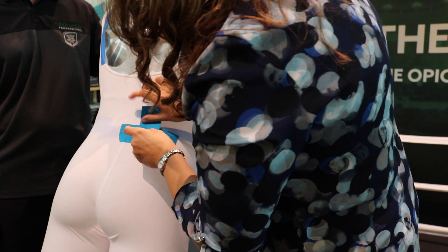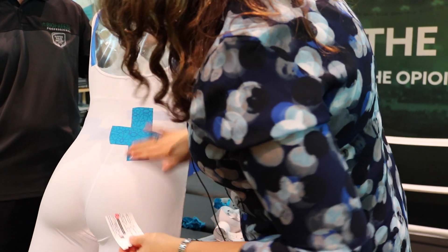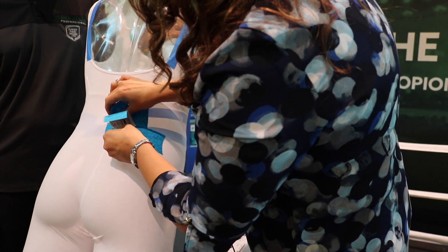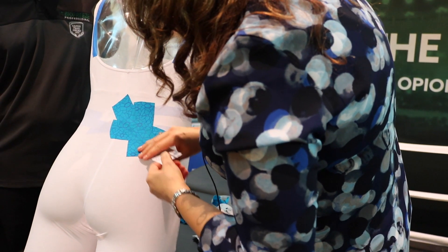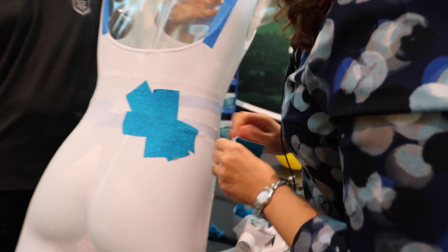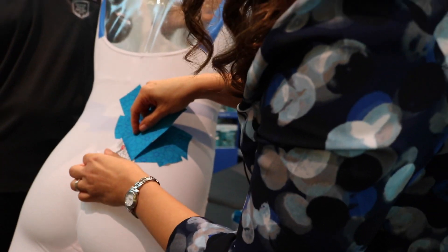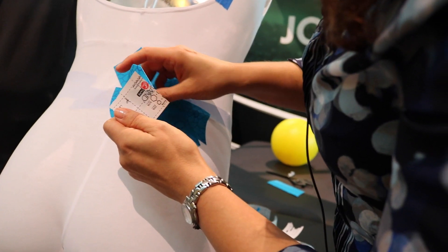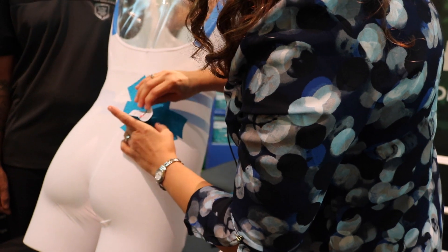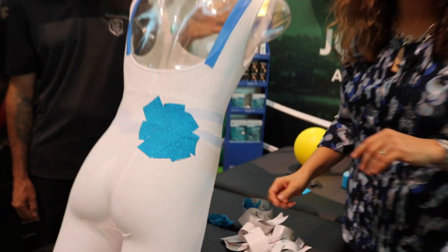As we lay down this next anchor, remember I'm not going to add any tension — keeping it at tape tension only. This works really well with dysmenorrheic patients and we can also do this with endometriosis patients on the posterior aspect. If the patient's pelvis is super sensitive and they're struggling with the taping, think about the next session and how much tape tension you're going to add. That's really it for our segment.